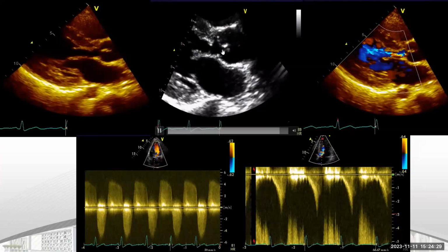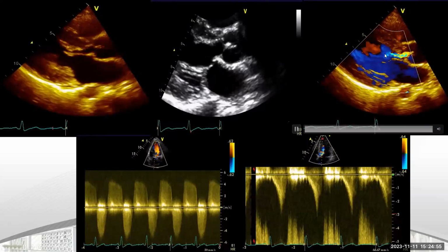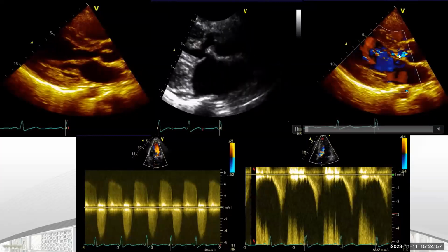We have aortic stenosis at the level of the valve, and we have here a subvalvular membrane or ridge. You can see this is the membrane or ridge. This is tunnel shape, so this is a ridge. A membrane is thinner. However, if you call this a membrane, that's excellent. In the exam, sometimes they may give you just a still image like this to show you the level of the stenosis. And as you see here, the flow acceleration started at the level of the subvalve.